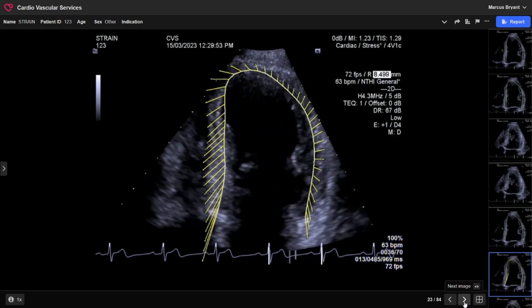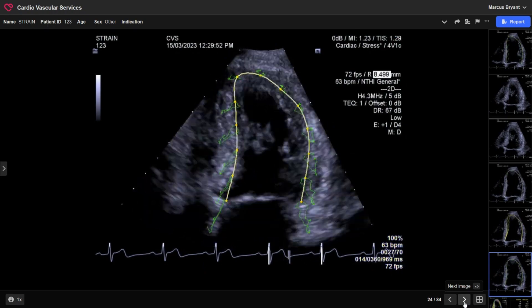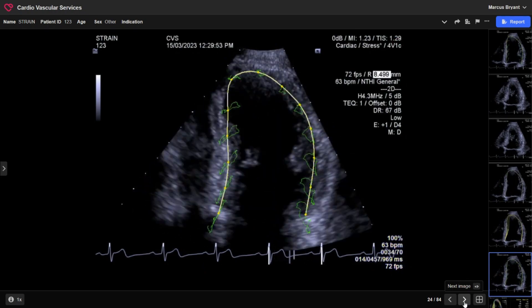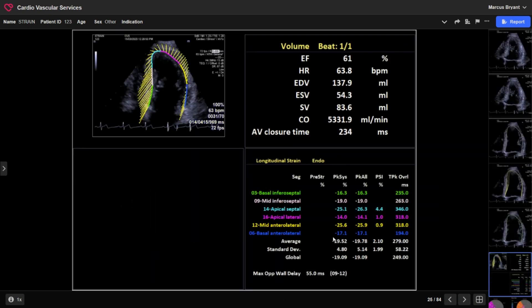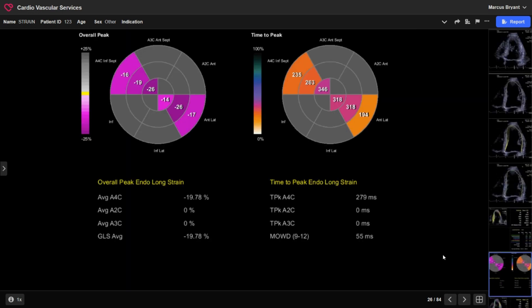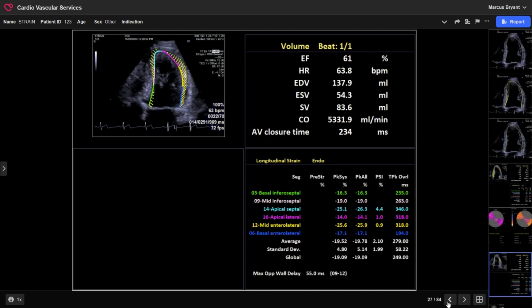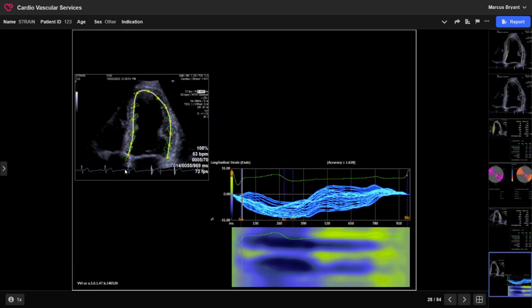Here's the standard classic view with vector velocities on, just showing the endocardial tracking and the numbers it produces. I often look at this and ask: what type of ejection fraction and volume am I getting, do they match my Simpson's values, do I trust them, and what's the range and distribution among these various numbers? I'd also always look at the bullseye and think how real it actually looks. If I have a particularly poorly tracking signal I may consider going back and reassessing, but here they're all not too bad and the overall global strain is quite fine.